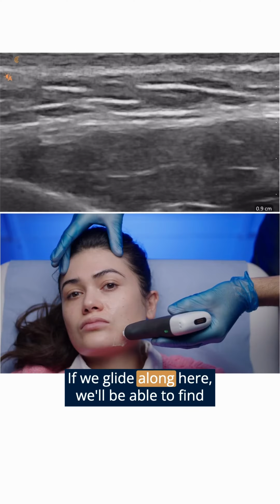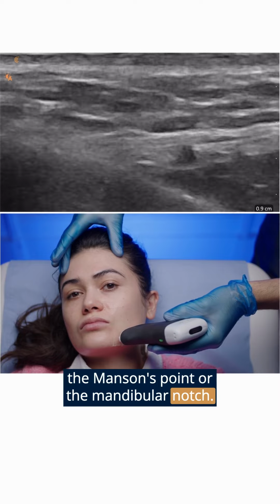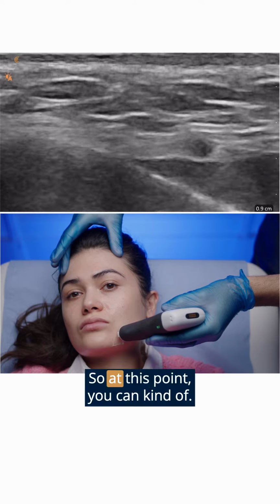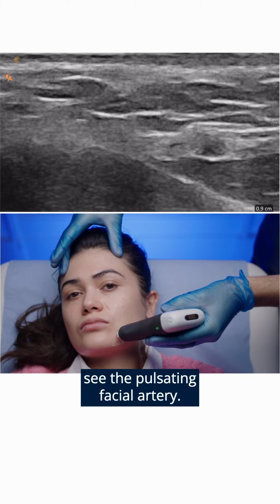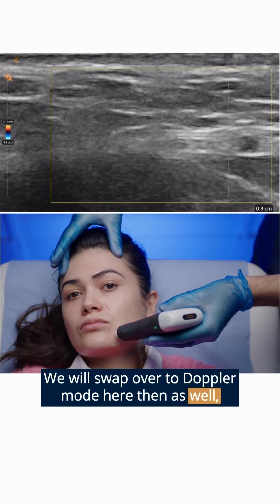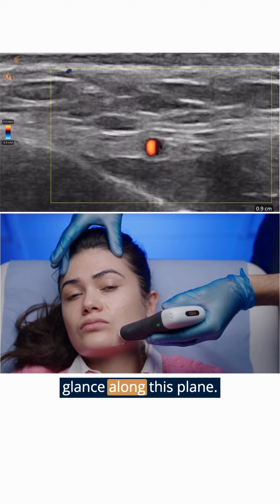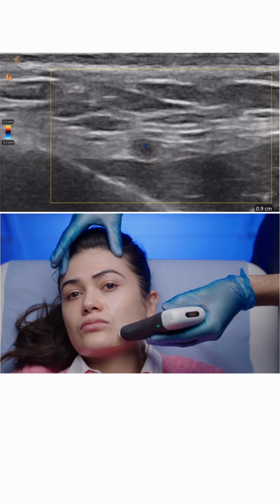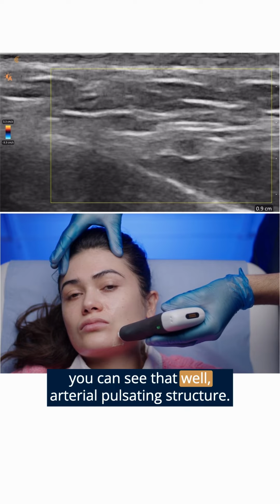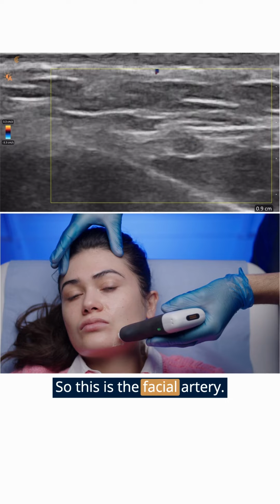If we glide along here, we'll be able to find the Manson's point or the mandibular notch, and along that point we'll be able to see the arterial tree. So at this point you can see the pulsating facial artery. We'll swap over to Doppler mode here as well, and we can then make it easier to follow this as we glide along this plane here. So bringing that back into the center of the screen, you can see that arterial pulsating structure. So this is the facial artery.